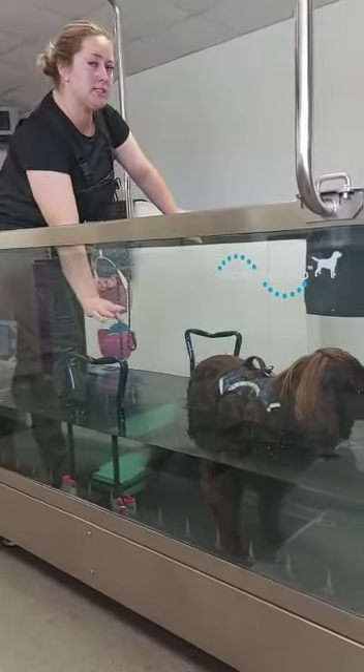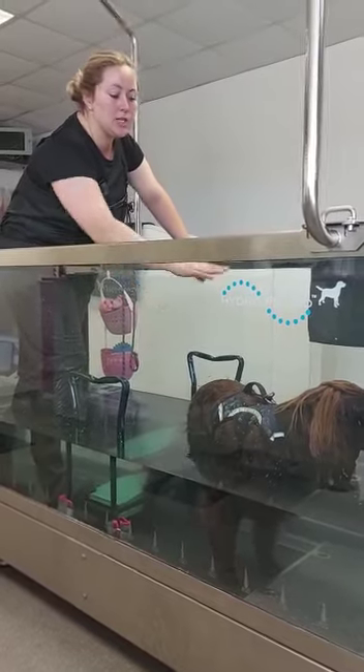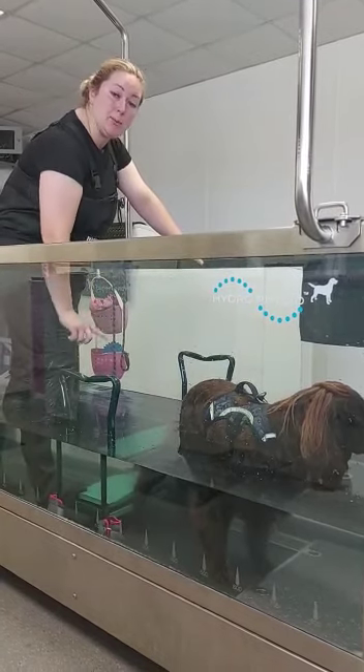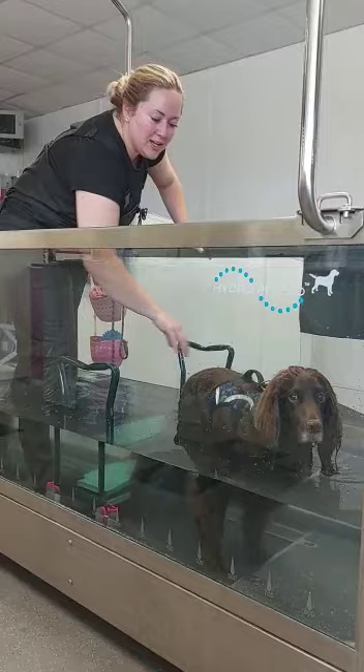I'm just going to use the step here within the treadmill - we're only going to use it static. I'm just going to get him to step over it. We'll test it first to see whether he doesn't need any step-over or whether he wants to step on and over. I have a feeling he's going to step on and over.